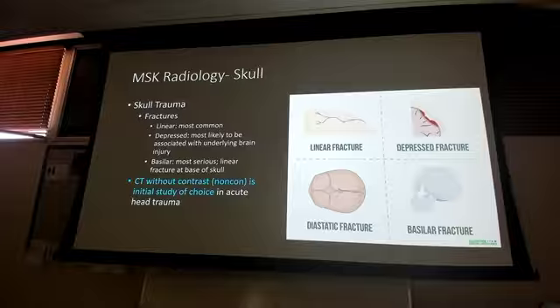Yes, sir? So would contrast just cause unnecessary illumination? Not unnecessary illumination. We will talk about why we don't do contrast in a few slides. I don't want to break that punchline yet. Okay? No, it's okay. I like that you're thinking that because you want to know what's going on. We talk about all these CTs with contrast. Why wouldn't I want it in the head? We will talk about that here in just a little bit. So non-con is your study of choice for acute head trauma.